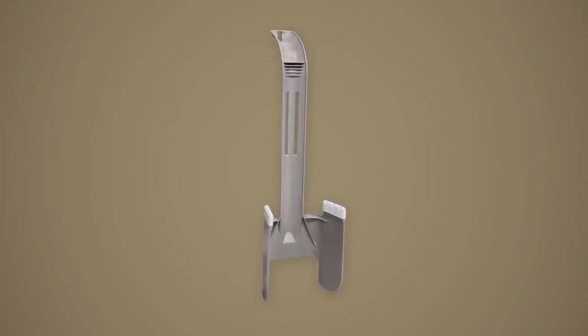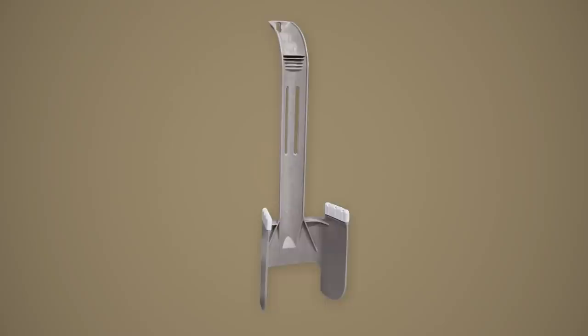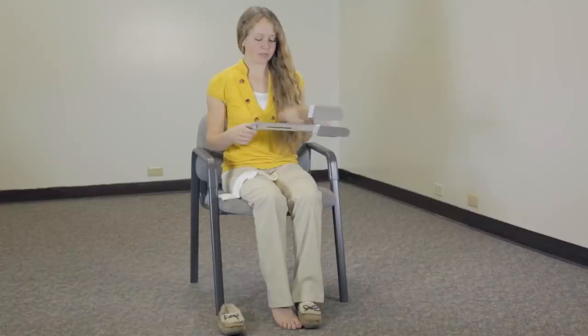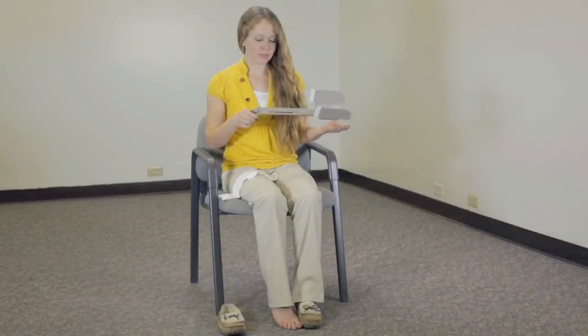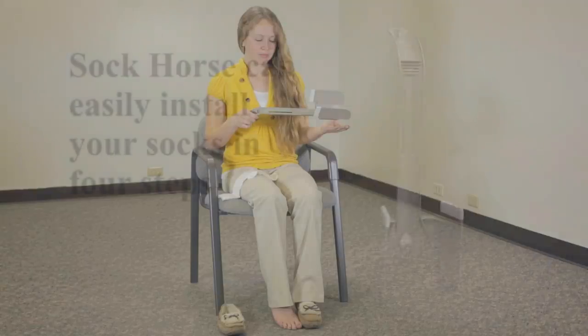The Sock Horse was designed to be the easiest and fastest tool to help you put on your socks. It features soft rubber grips that are gentle on delicate socks. It has a ribbed thumb grip and ergonomic contoured handle, as well as an extra long handle that is nearly 18 inches long to reduce bending and strain.